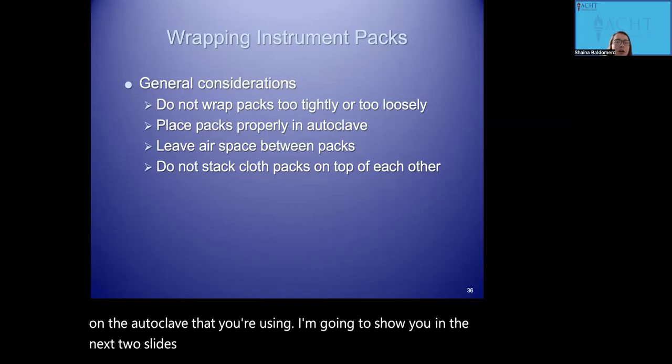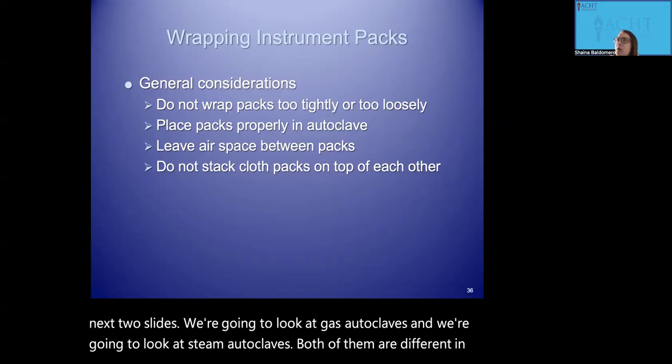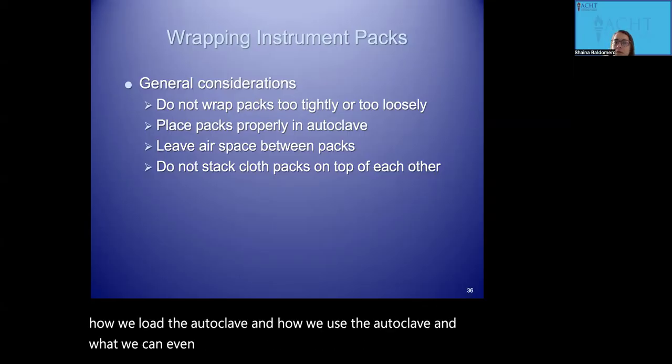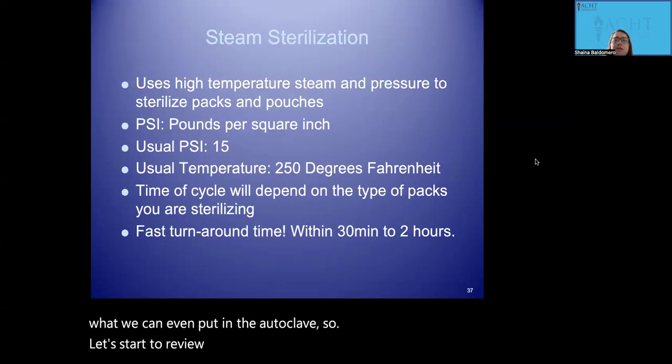We're going to look at gas autoclaves and we're going to look at steam autoclaves. Both of them are different in how we load the autoclave and how we use the autoclave and what we can even put in the autoclave. So let's start to review the different types of sterilization.